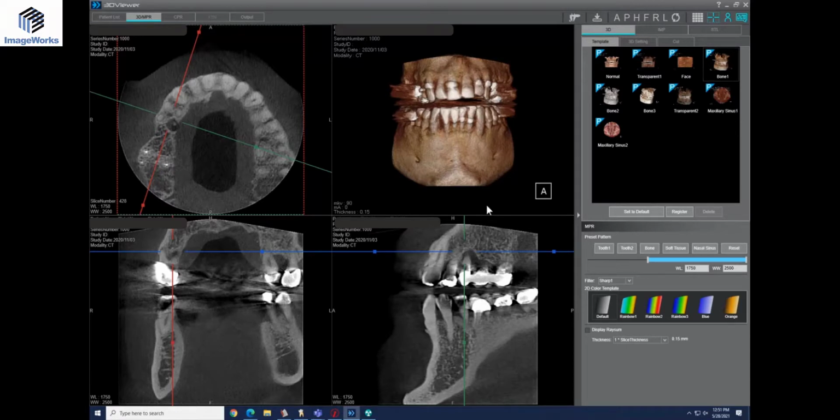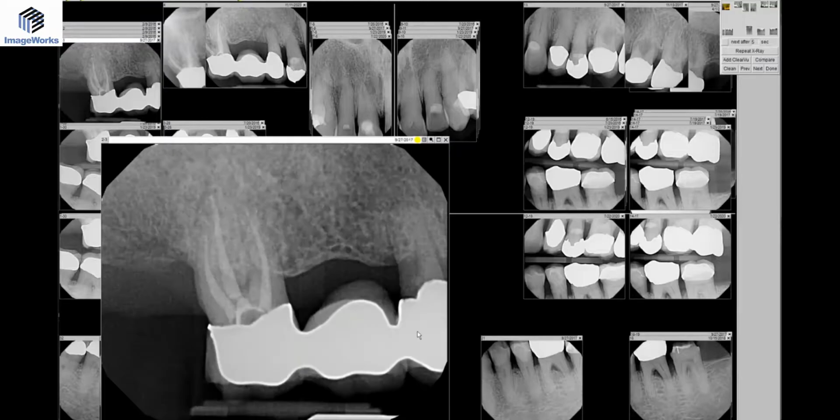It's amazing, right? I mean, it's funny, to your point, how you would get this information with just 2D tools. It's hard to imagine. Right. Let's see if I have. See, this is how he presented with the regular radiographs. Yep. And it just really picks up probably the buccal root with the lingual root superimposed, and the bone looks fine, but it's all blown out on the other side.